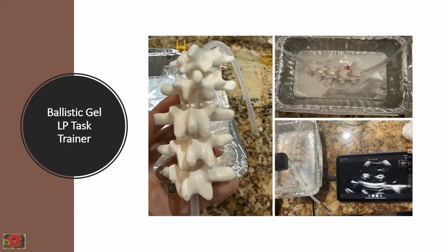Yeah, and I think the ballistic gel is really good at keeping the space that you create holding together just by the consistency of the ballistic gel. Like when I remove the metal straw, I make a couple of turns and make sure that the gel is completely cooled down, like the 10 hours. So when I remove the metal straw, the space is maintained. It does not collapse because now it's solid.